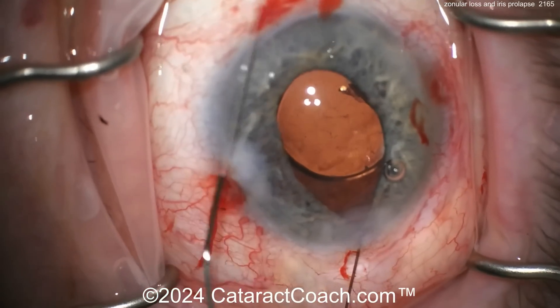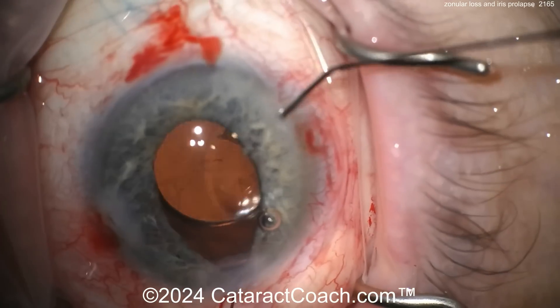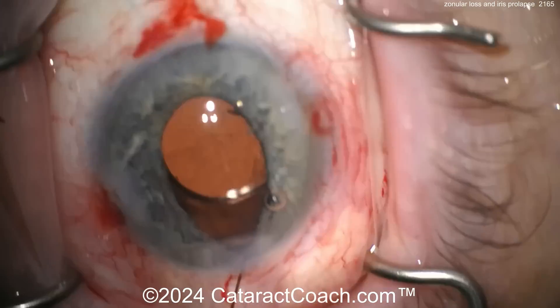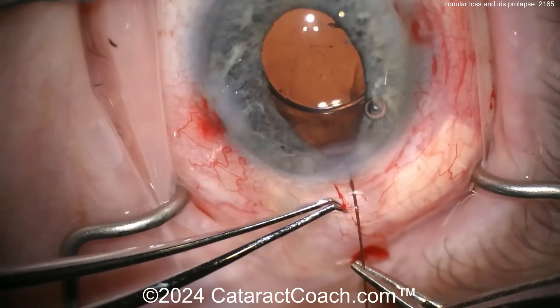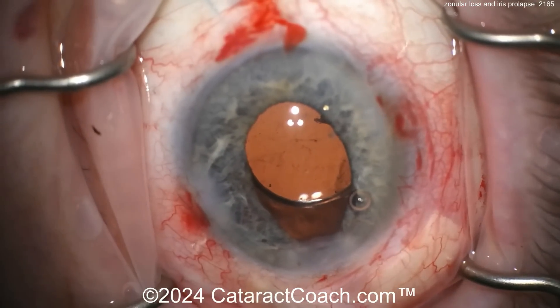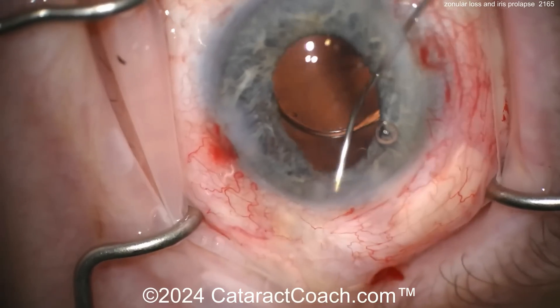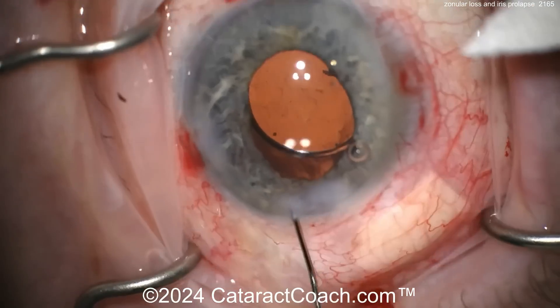So what are you going to do here? I'd certainly want to put a 10-0 nylon on that incision because look at that iris — it already wants to keep burping out. Make sure there's no vitreous coming out there too. Here's that sub-incisional hook — get rid of that thing. Can you bring that iris back down to a nicer, more round configuration? There you go — looks like it's making some progress.